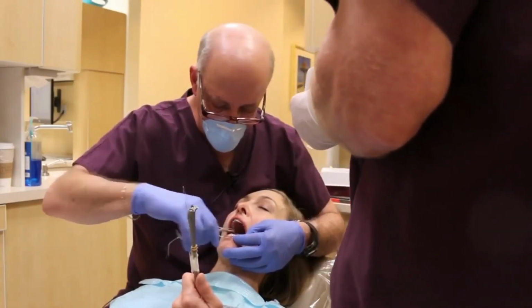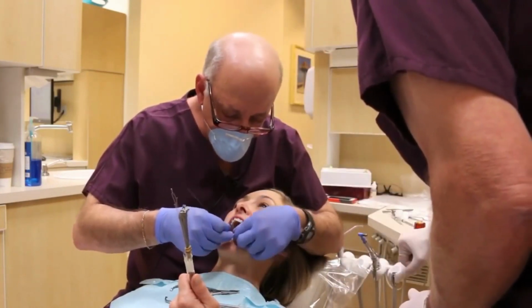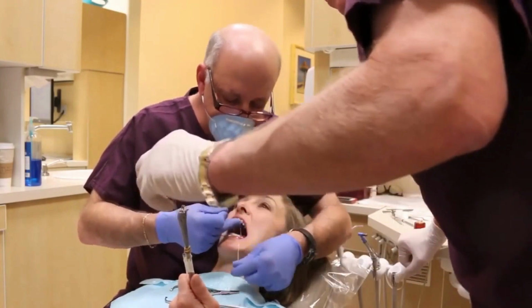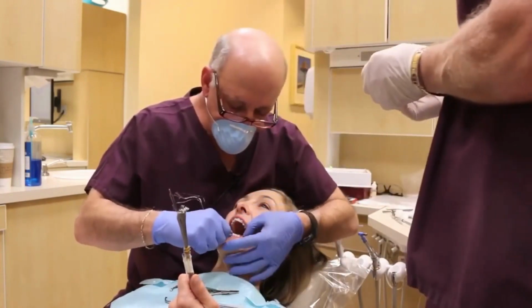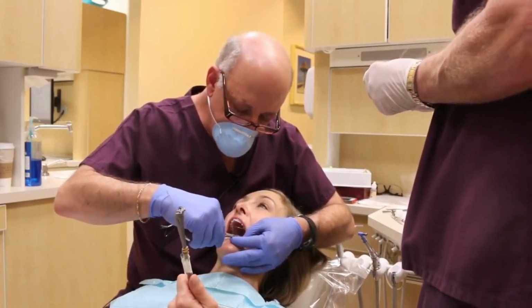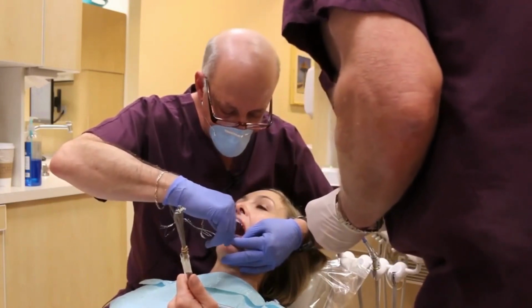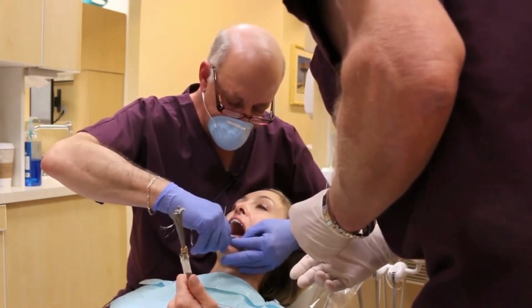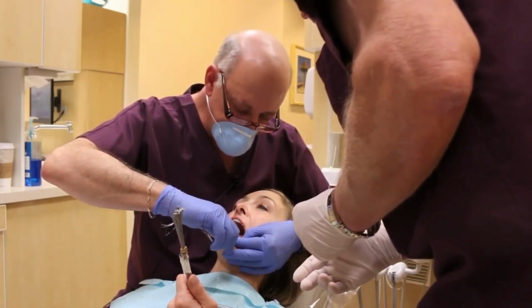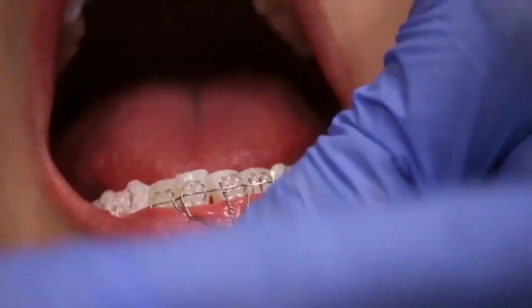get that tooth derotated. Also, this cement, even though it's hard within the first 8 to 10 seconds, it really takes time to fully cure. And if you are stressing the bracket by trying to bring the wire in with the pigtail by putting force, you might end up debonding your bracket. So it is a much better idea to push the wire fully with an instrument and then just tie.